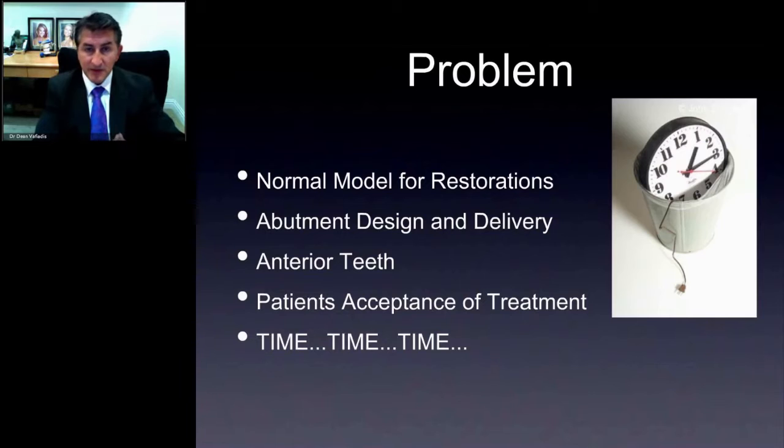So that being the case, we realize that CAD-CAM technology is going to help us to decrease the time of fabricating the crown. The abutment design is another issue that has been perfected and gotten a little easier, to get a better emergence profile. So that also, from the digital perspective, is easier to control the emergence profile.